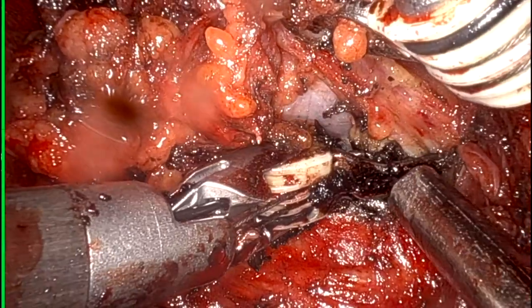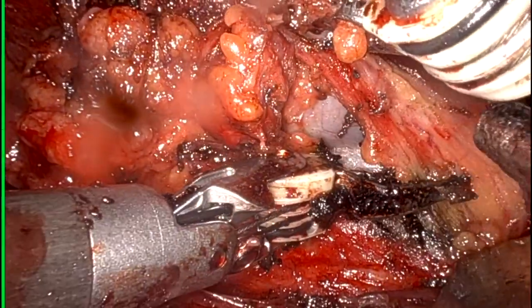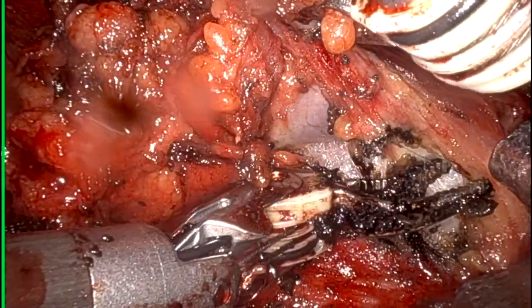In this case, we started with lateral to medial, then came back medial to lateral, and finally we took the entire tissue lateral to medial.